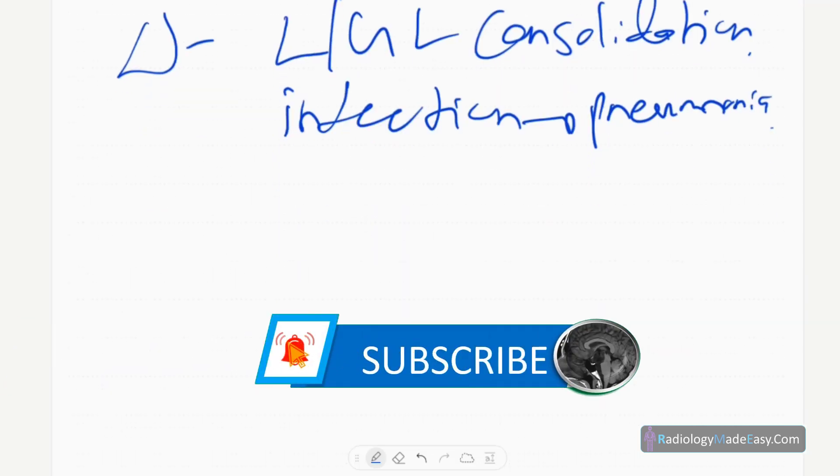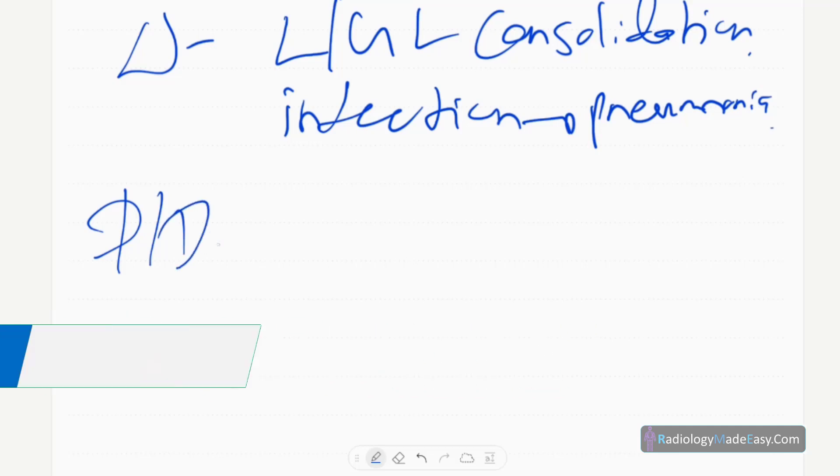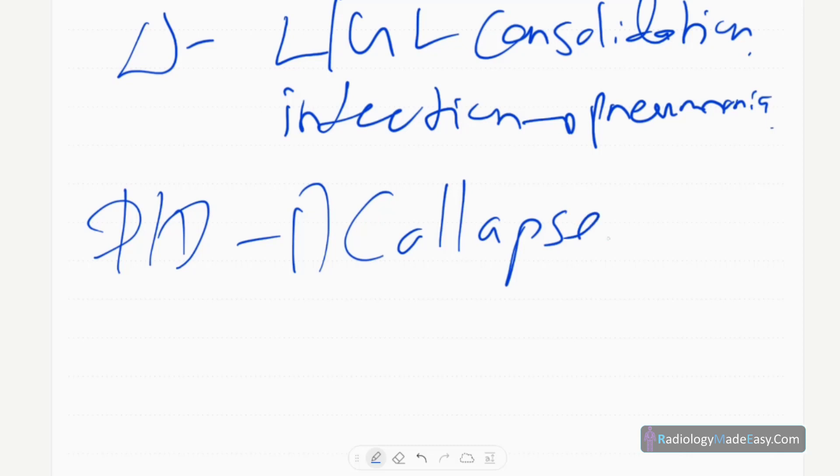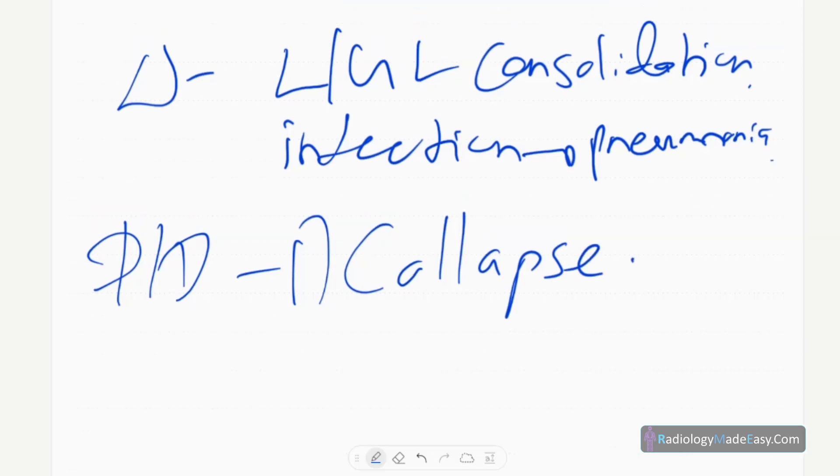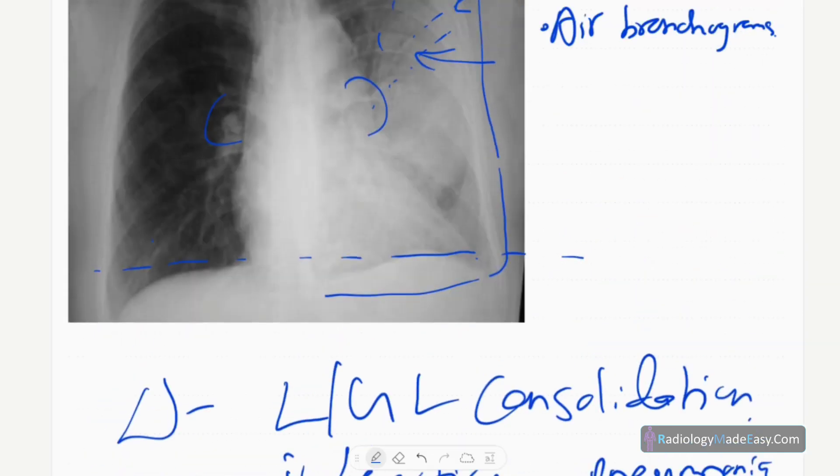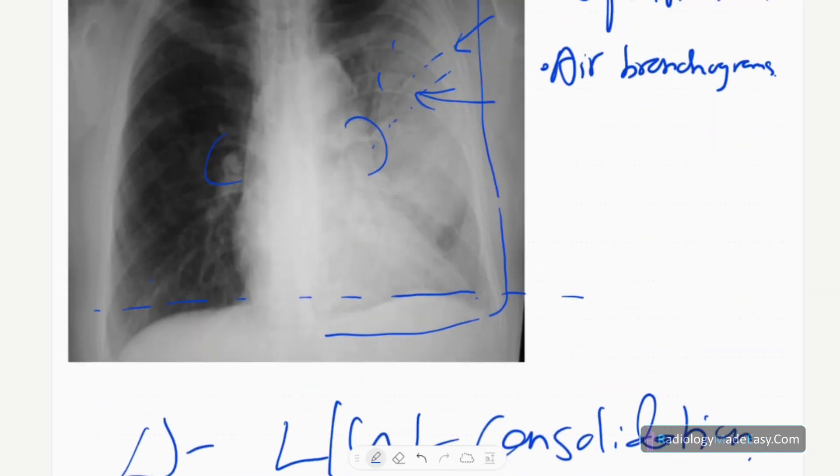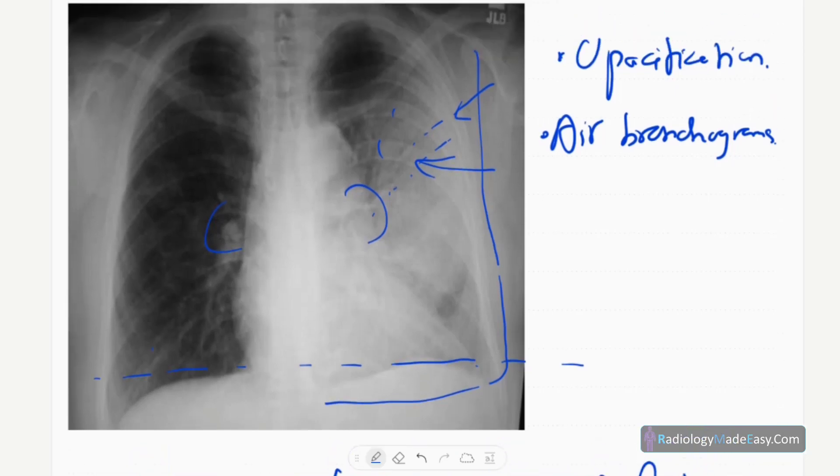The differential diagnosis for these appearances: one is lung collapse. In lung collapse, there's volume loss, usually mediastinal shift to the same side. In consolidations, there's no volume loss.